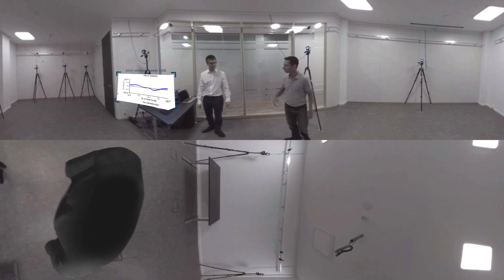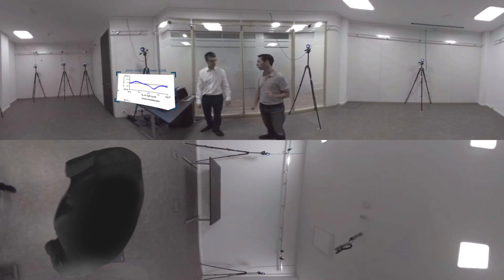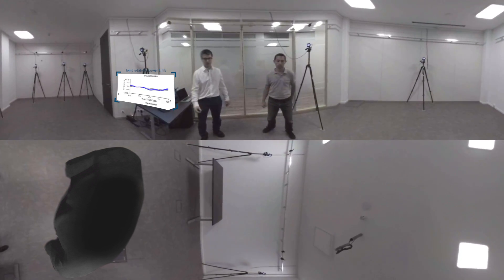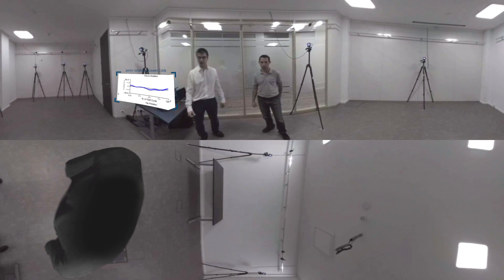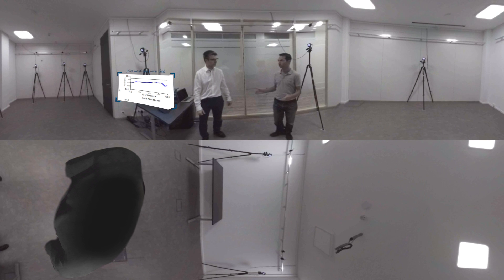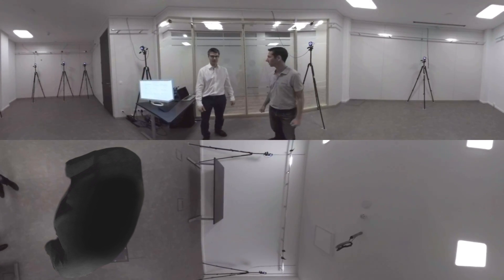The 3D virtual twin of the patient was quite useful for surgery. With this simulation technology, we were able to personalize the treatment in order to achieve long-term success. So what we can do now is wish that gentleman a happy walk. Yes, we can.